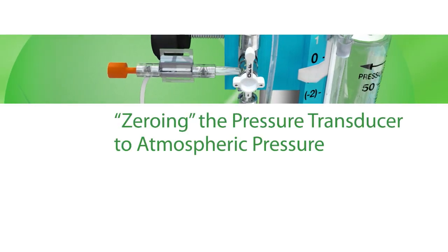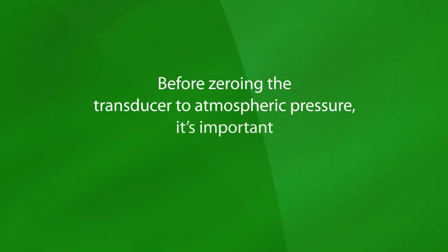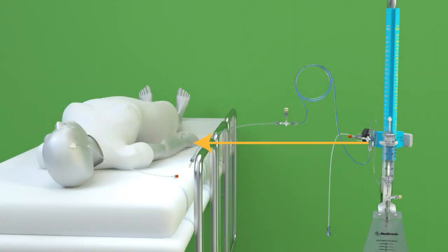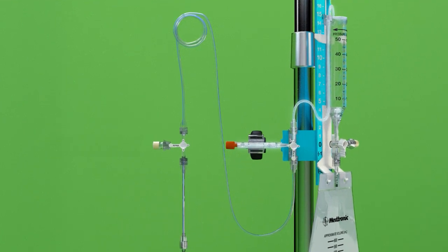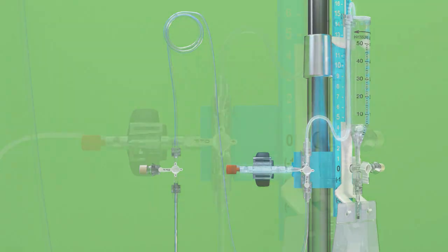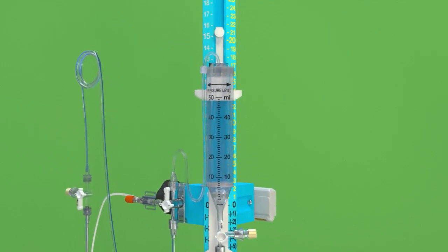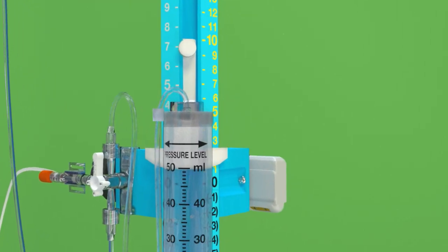Zeroing the Pressure Transducer to Atmospheric Pressure. Before zeroing the transducer to atmospheric pressure, it is important that two conditions be met. One, the drainage system should be level with the patient. Two, the tubing between the transducer and the top of the drip chamber must be completely filled with fluid. Start by turning the main system stopcock off to the patient, but allowing communication between the transducer and the drip chamber. Lower the drip chamber until the white plastic wings on the drip chamber bracket are aligned with the zero position on the pressure scale.